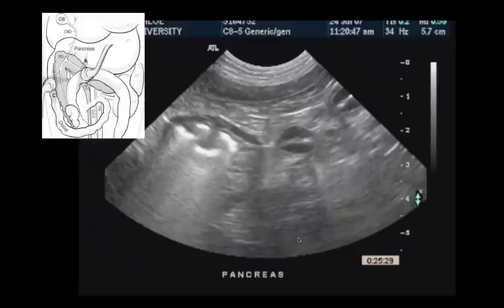During the video clip of the real-time evaluation of the pancreas, we will scan starting from the left side of the stomach at the level of the fundus body, and we'll slide the probe from left to right along the side of the left limb of the pancreas up to the place where we will identify a transverse view of the descending duodenum, and then follow the right limb in both transverse and sagittal orientation, and we'll finish the scan returning towards the left side of the pancreas.